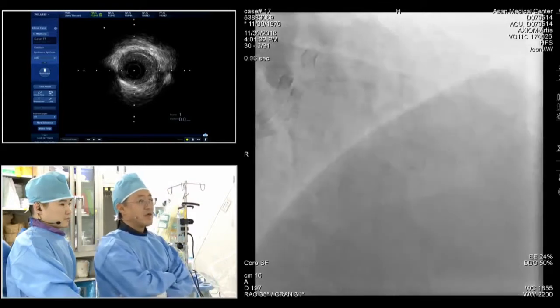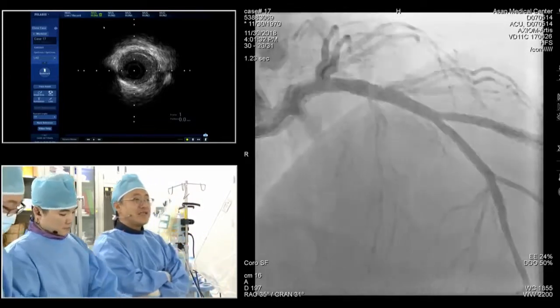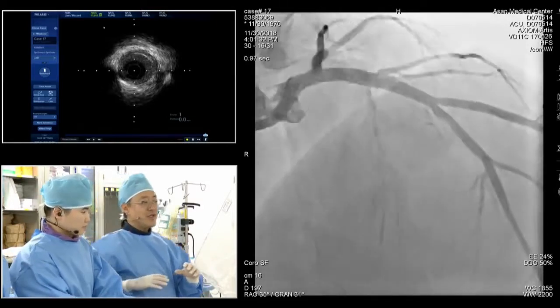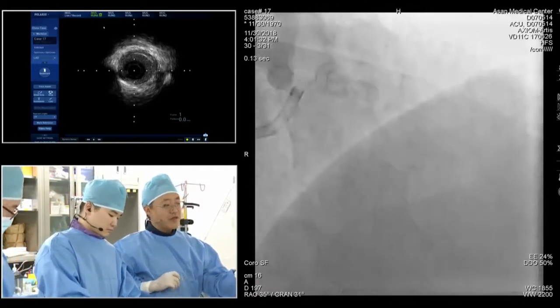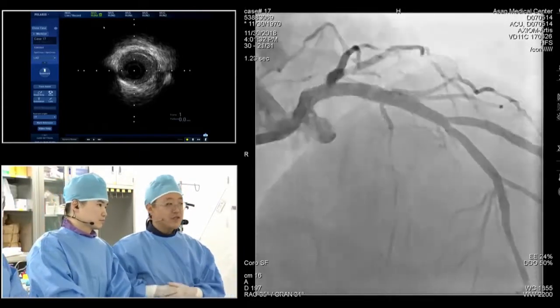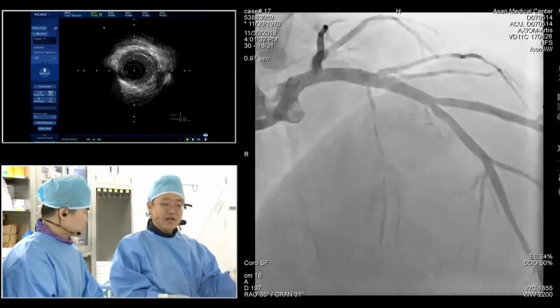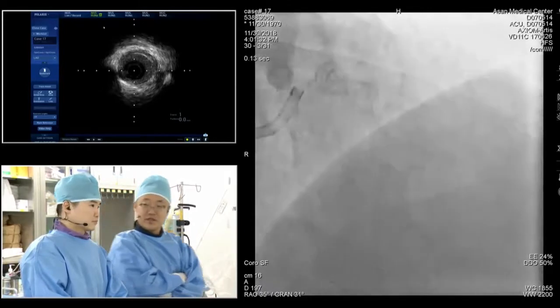Do you think that this was a kind of recoil or compression? Yes. So at this time I didn't recheck the end IVUS. But usually we try to meet our value of 5, 6, 7, 8. But there might be some possibility of recoil, or the ostial region is sometimes vulnerable to recoil. So it's one of the mechanisms for the circumflex ostial ISR region. I will check the final IVUS again and let you know.